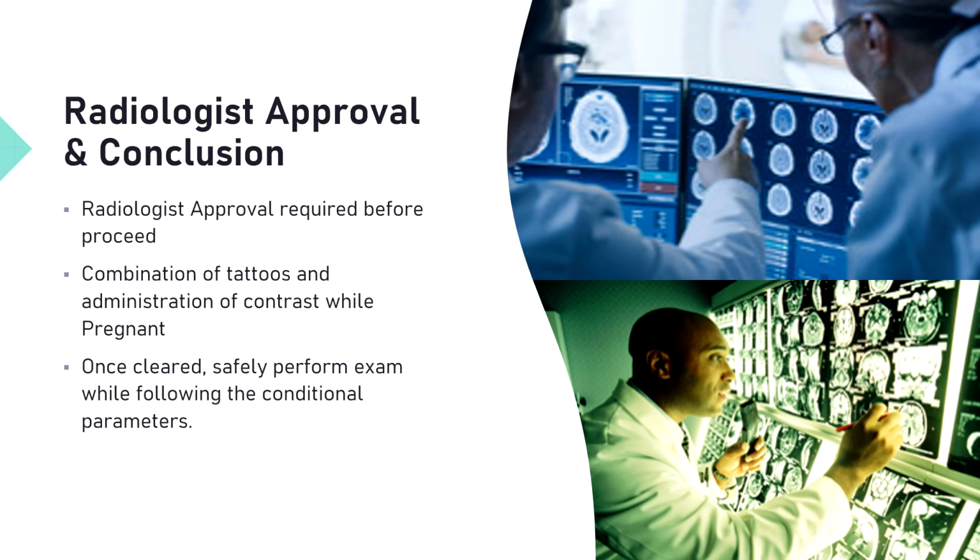Once the radiologist provides a written order to proceed, we will follow all conditional safety protocols. In conclusion, by identifying these obstacles early and consulting the proper safety resources like mrisafety.com, we can prevent patient injury and ensure a successful diagnostic study.